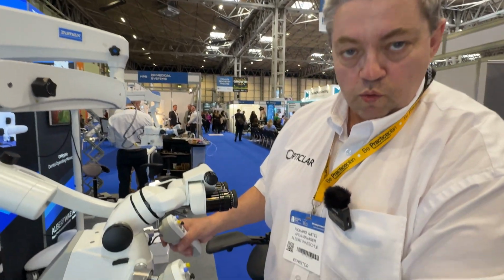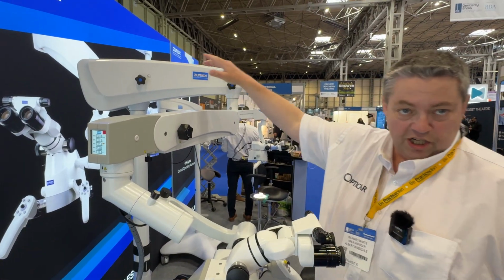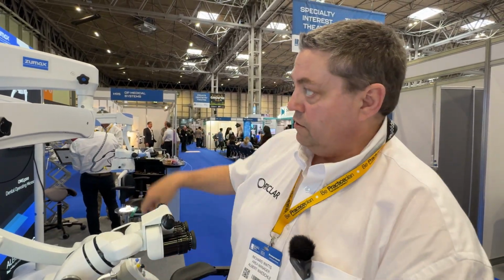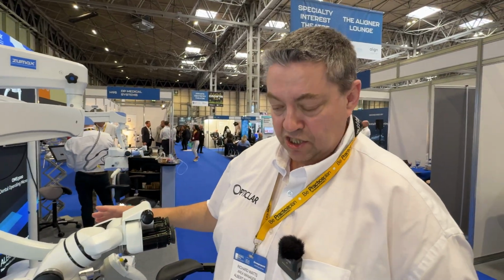On the version with 6 electromagnetic joints, it also does these joints here. So the one with 6 electromagnetic joints, you get more freedom of movement. This one, you've still got your traditional friction screws there, but you've got your electromagnetic. How often do people want the electromagnetic brakes? It's nice to have, but it obviously adds cost. So I think if it was the same cost for both versions, everyone would go for the 6 electromagnetic.